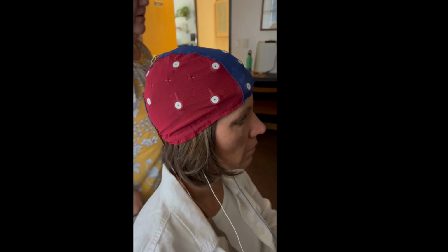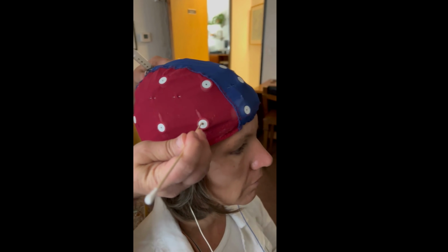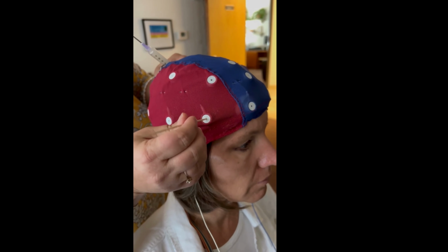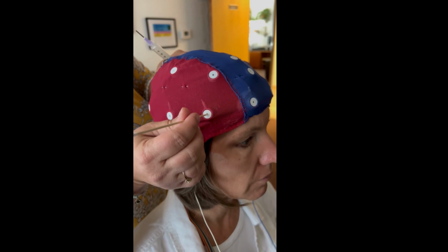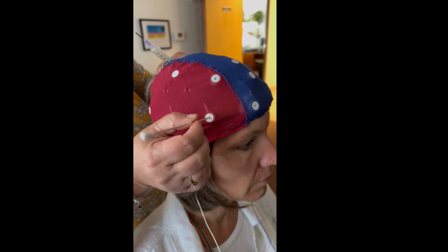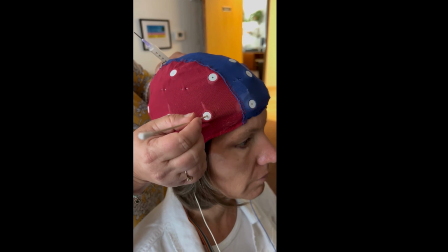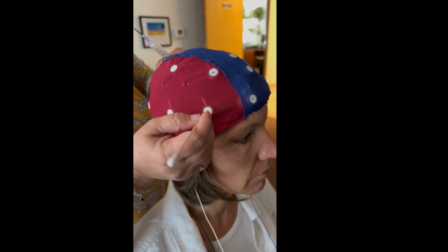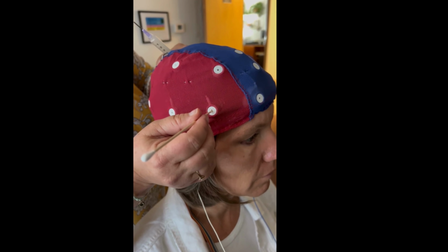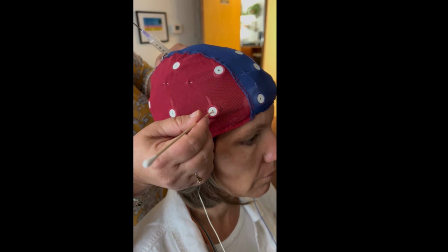So what we'll do is we'll come back over to that F8 and we will take the non-cotton side of the Q-tip and we'll just put it in the hole here and just lightly, you can feel when you're at the skull, and you just want to move it around, twist it in your fingers a little bit. You maybe rock a little bit back and forth if you're in an area that has a heavy amount of hair.